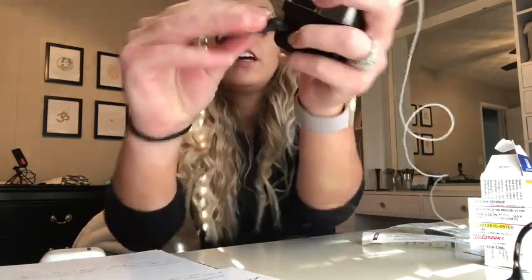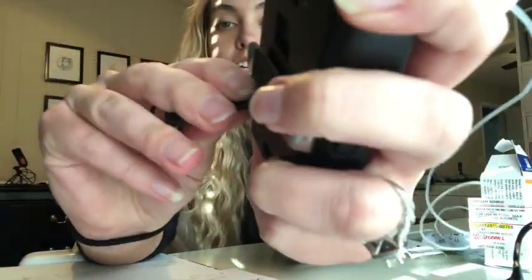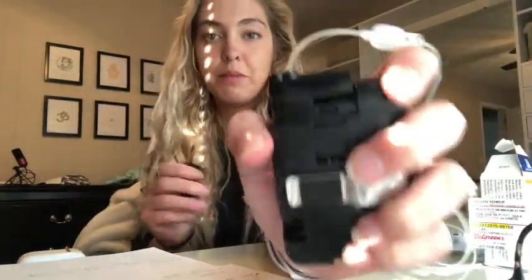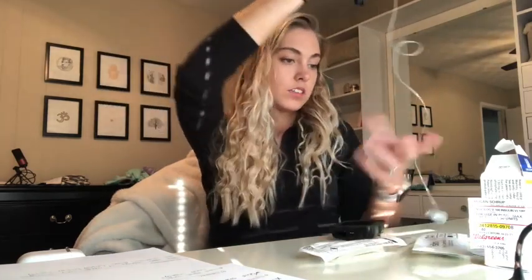So I am going to do a Tslim pump site change, and I just thought I would share it. So this is the pump, and they send you this little tool to use to pop the cartridge out. You can also use a coin, but I just use the little tool. And then I just go ahead and press up until the cartridge pops out like that. And then this is just trash. So I'll throw that to the side.